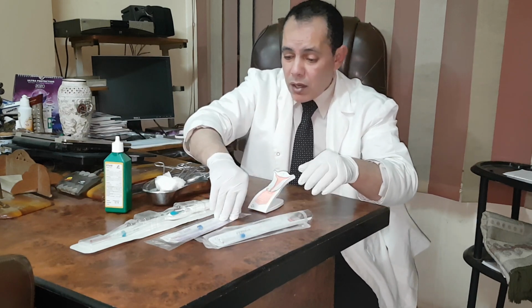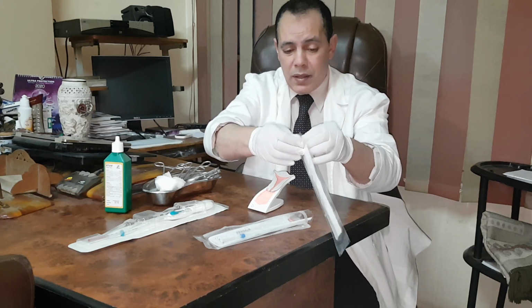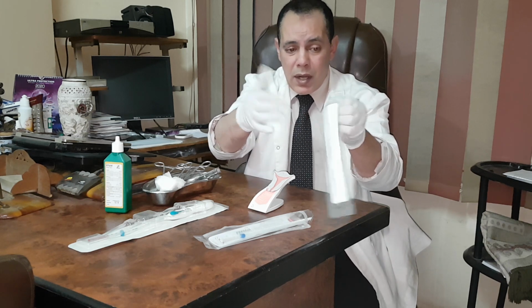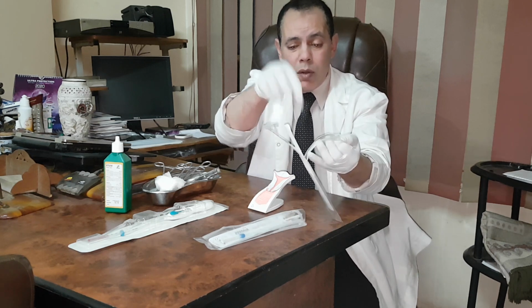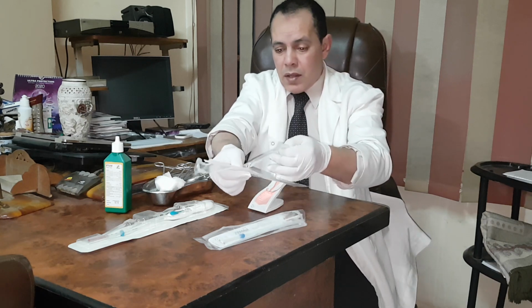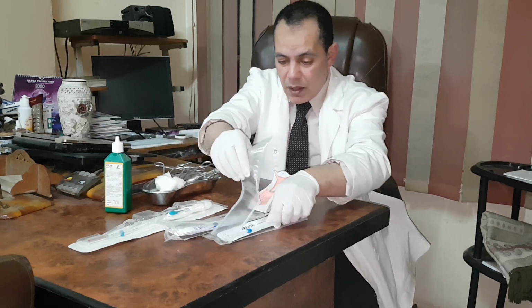Of course, they are closed in a sterile package, as this one. We open it like that. And of course, we wear sterile gloves. Somebody helping you to open it like that, and all things inside are kept sterile. Okay. So, let us see the different types of IUD.